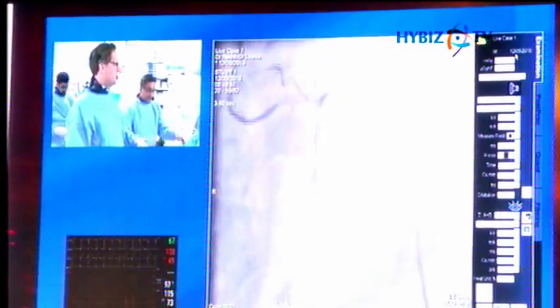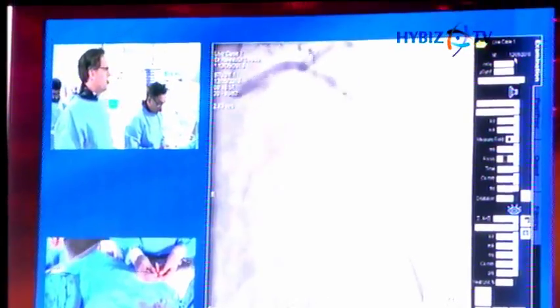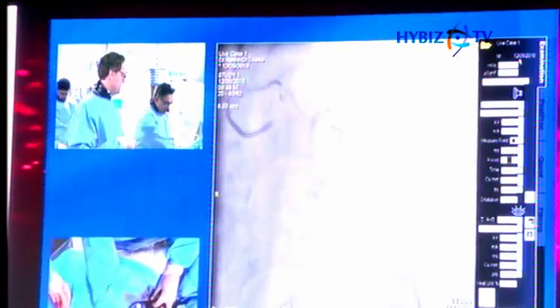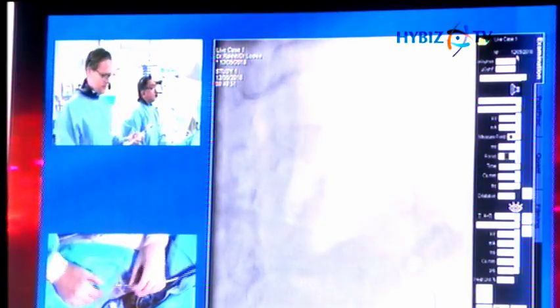But the very nice thing about it is that it's self-apposing. In the Apposition 3 study, which was a randomized trial in STEMI with OCT follow-up, they really found that, especially in STEMIs and other cases where you get a lot of vasospasm and a lot of thrombus in the vessel, when that all melts away there was a huge difference. Probably all of us undersize our stents in STEMIs, and this really overcomes a lot of those problems. There was a real improvement in stent apposition on the follow-up studies, which was very nice.